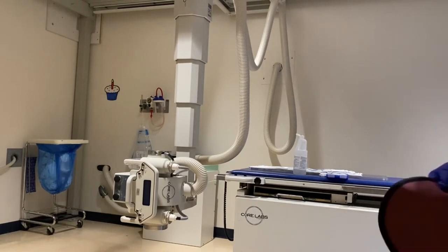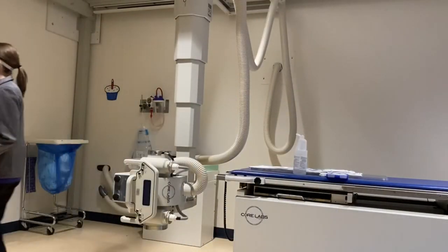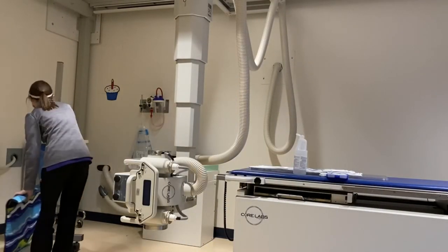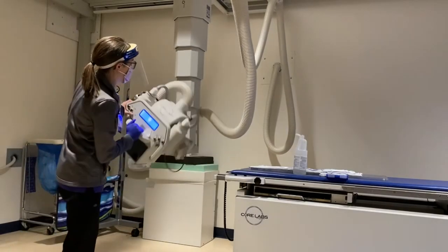Here I'm just cleaning everything up now that the exam is done. That is the rolling shield. We're able to shield patients while they're standing by using that so that it's not touching them.